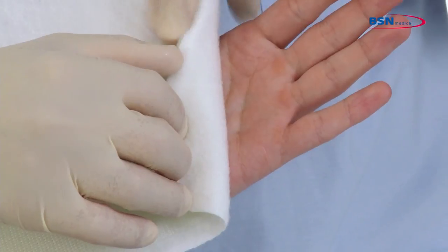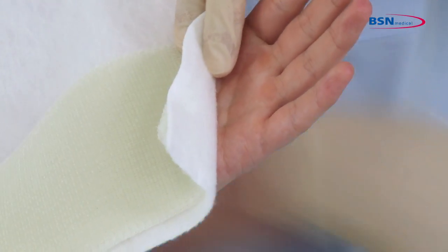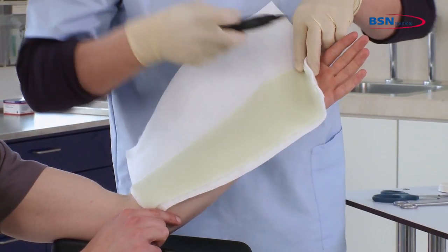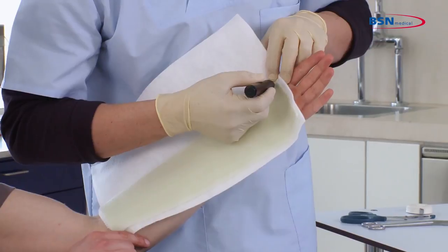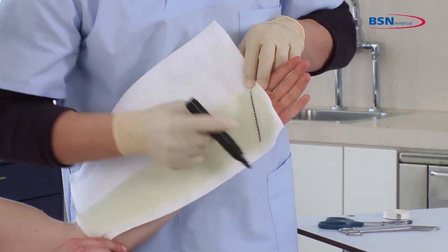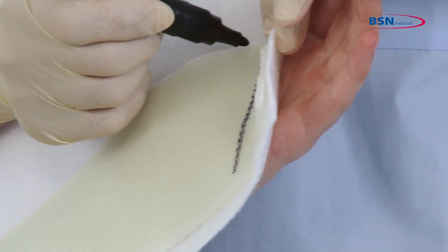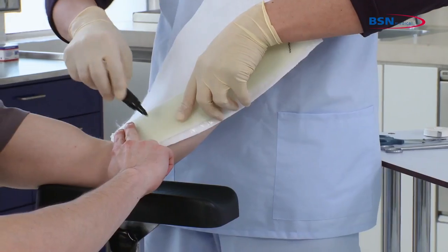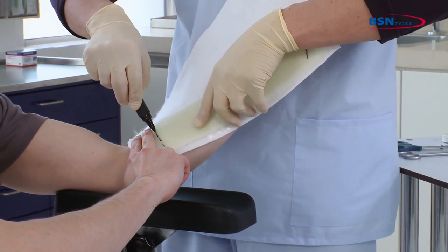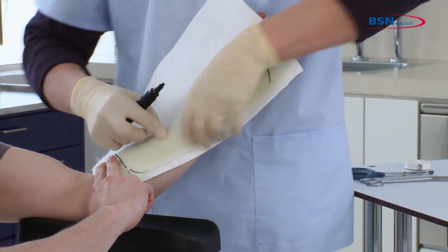Align the distal end of the splint with the angle of the palmar crease. Next, fold one edge of the splint over by following the palmar crease and mark this line on the substrate. It is optional to also mark a line around the thumb area. Allow the patient to have more space at the antecubital part of the splint, and cut and trim the substrate there as well.